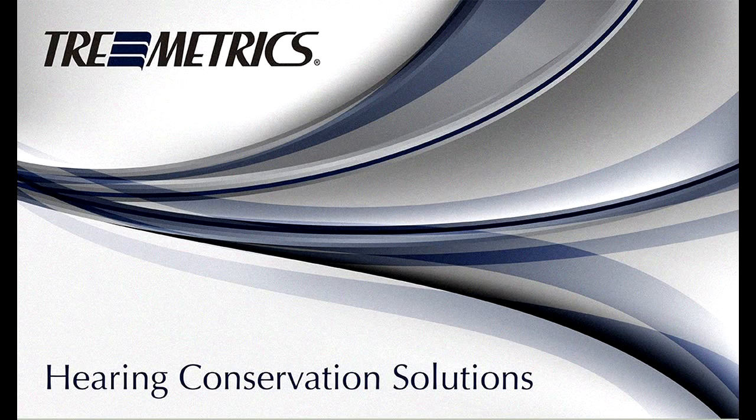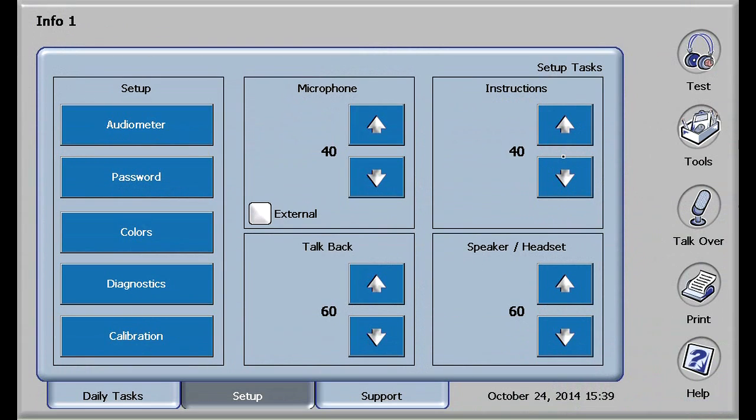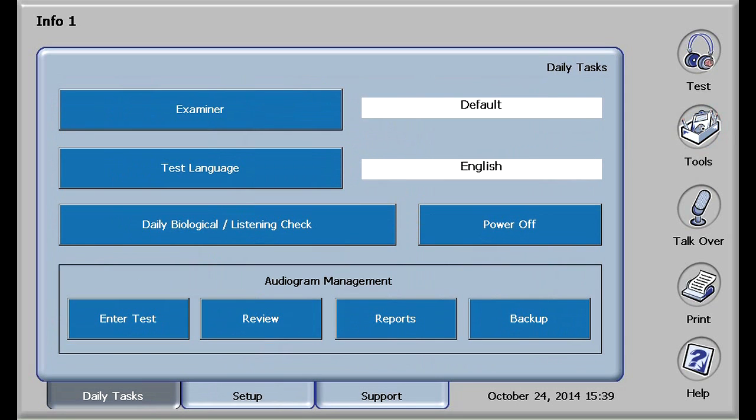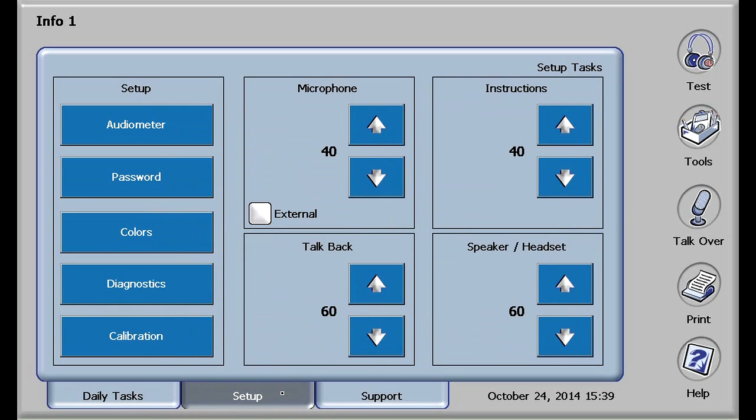Starting from the home screen, touch the color display and go to the daily task screen. This screen can also be reached by touching the tools button on the right hand side of your screen. Next, touch the setup tab at the bottom of your screen.